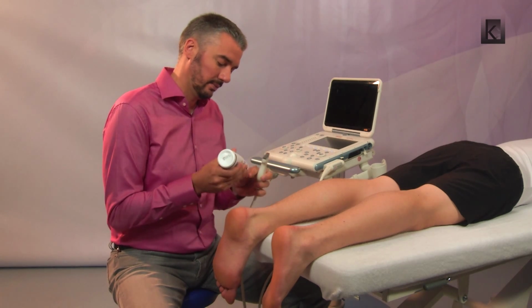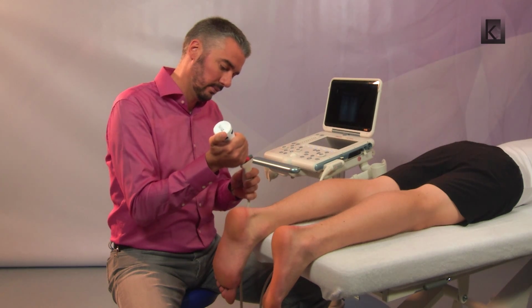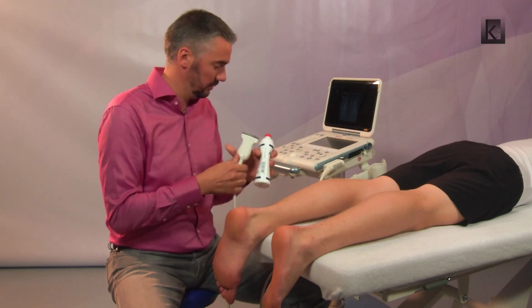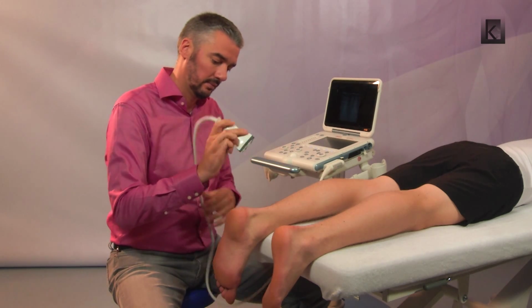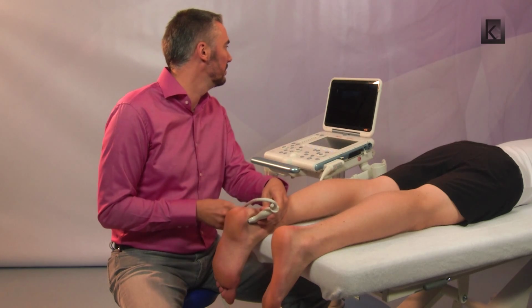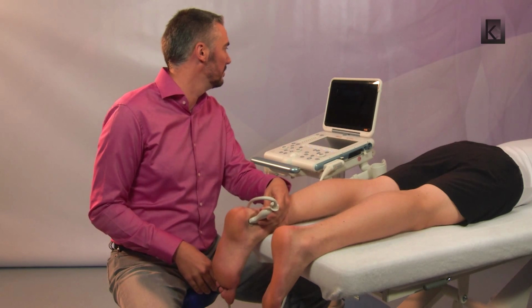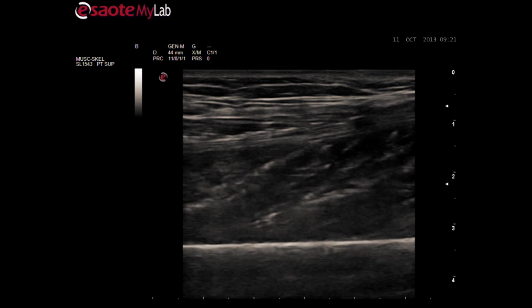The flexor hallucis longus muscle and tendon can also be scanned directly. The transducer is placed slightly medial from the Achilles tendon. Again, the foot is placed in the end range of dorsiflexion to create a stretch on the flexor hallucis. This enhances the depiction of the tissue. At 3.5 cm of depth, we can see a bright white horizontal line. This is the tibial bone.